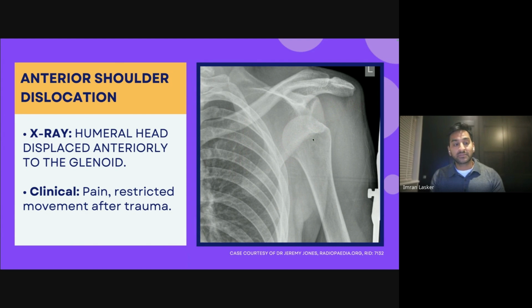So what you'll find sometimes is people come in and say, yeah, this is not the first time. It's not my first rodeo or something like that. So it basically means that they've got an instability to the shoulder, and it's not always a bony instability. Do you remember when I said that you can get the sort of cartilage stuff? That's called the fibrocartilaginous glenoid. Sometimes that's injured, and that results in this instability.